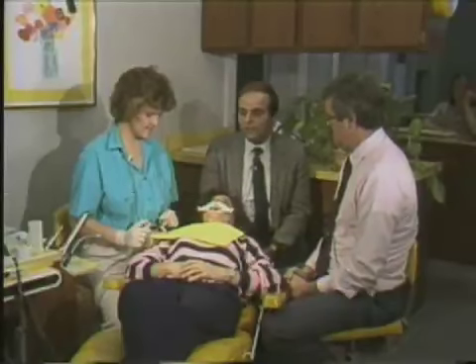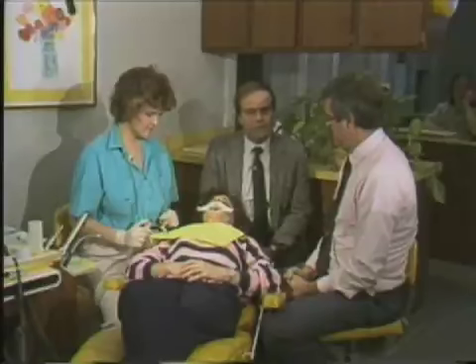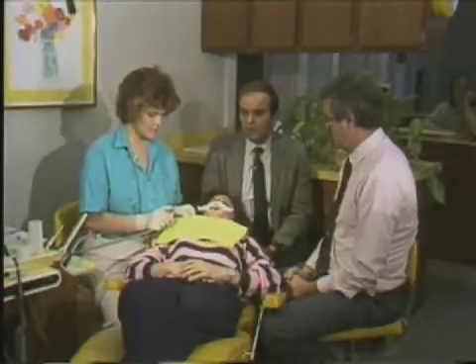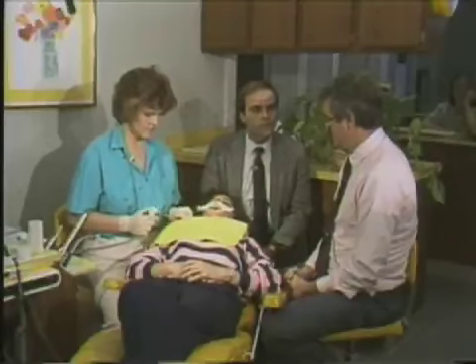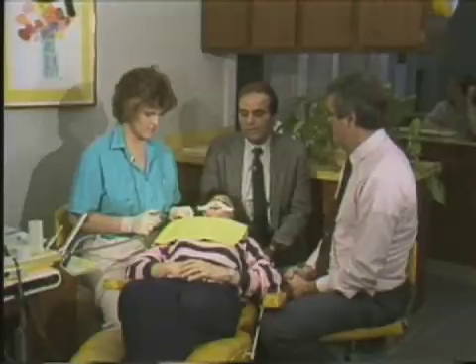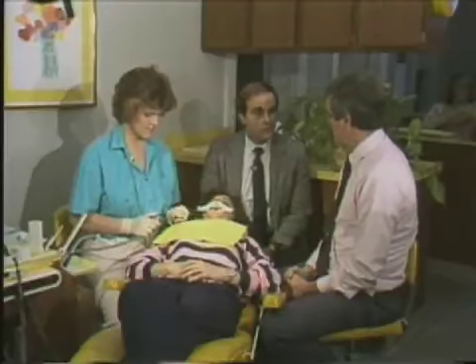The acid should be rinsed off the enamel with a combination water-air spray. And the manner in which Liz did this was she ran the water-air spray across the arch back and forth once or twice, and that stopped the etching process. Then she went back with a concentrated effort on each tooth for 10 seconds because she used a liquid etch.